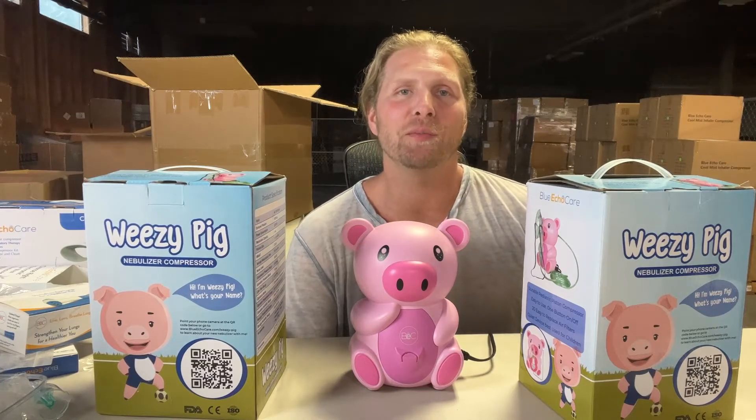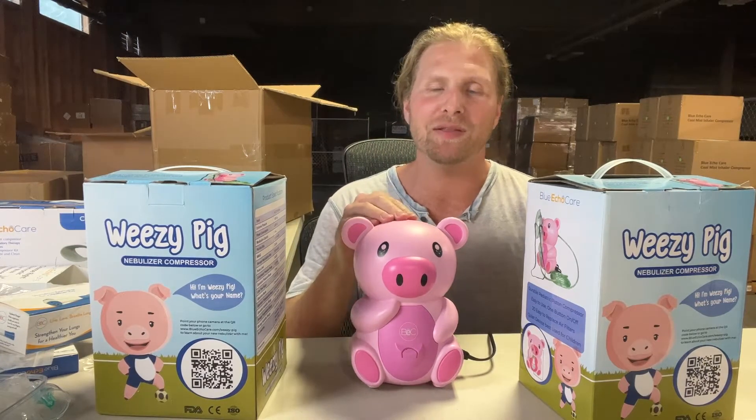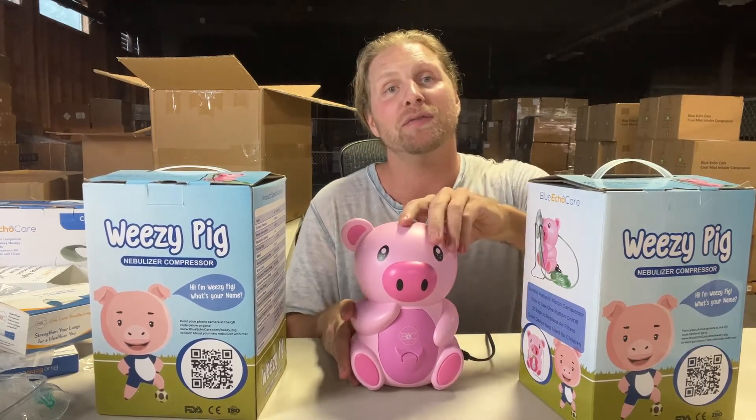Hi everyone, this is Ed Wagner, the owner of Blue Echo Care and the owner of the Wheezy Pig line of children's nebulizers. Today we're going to be talking about changing filters.